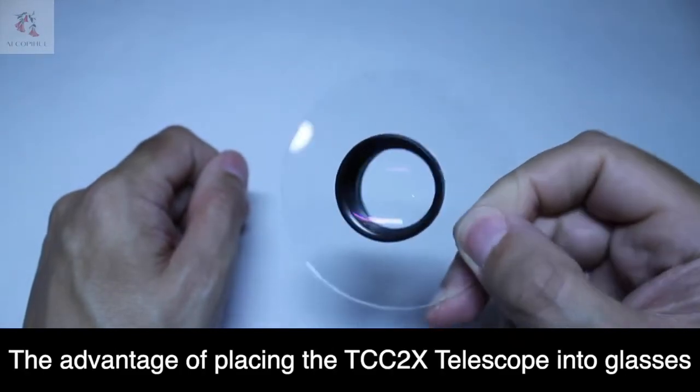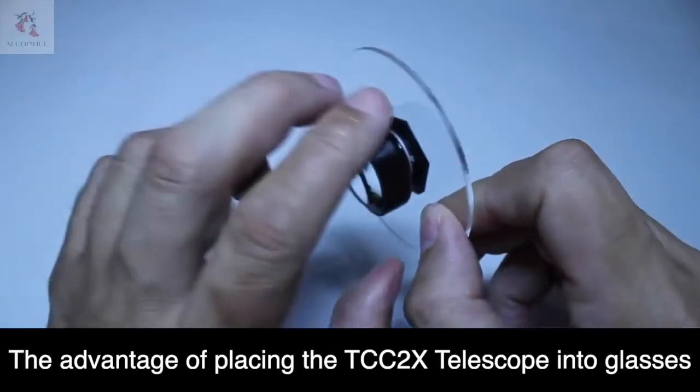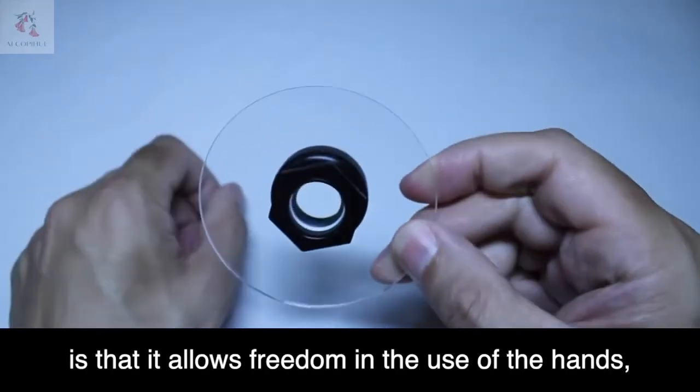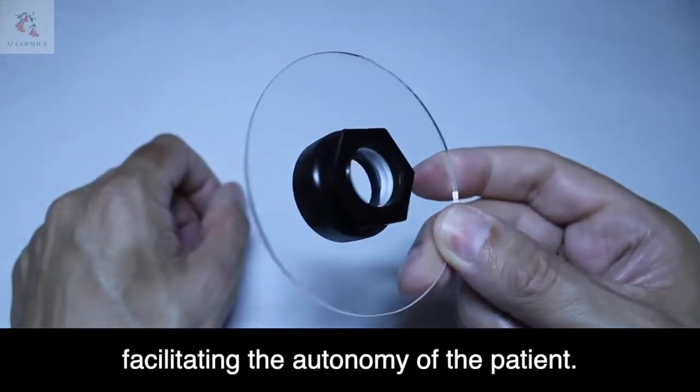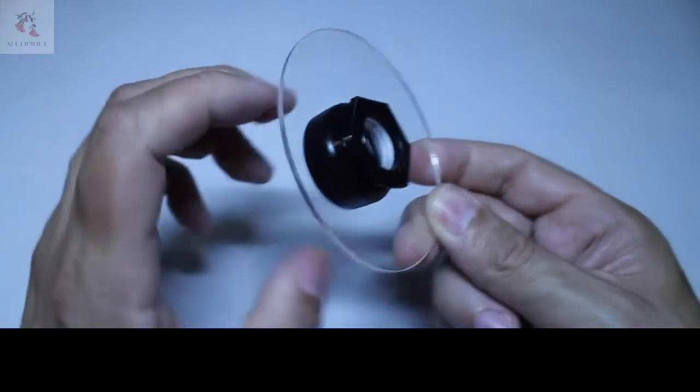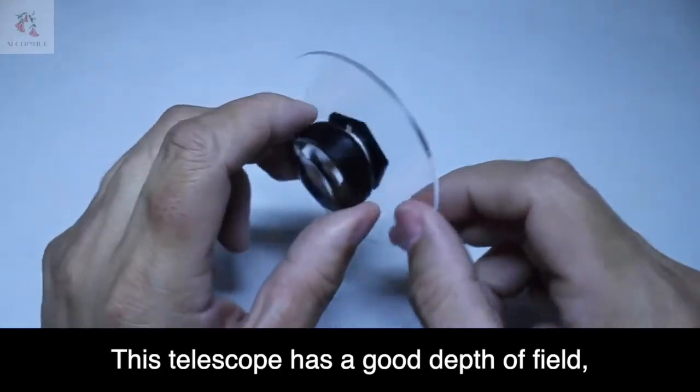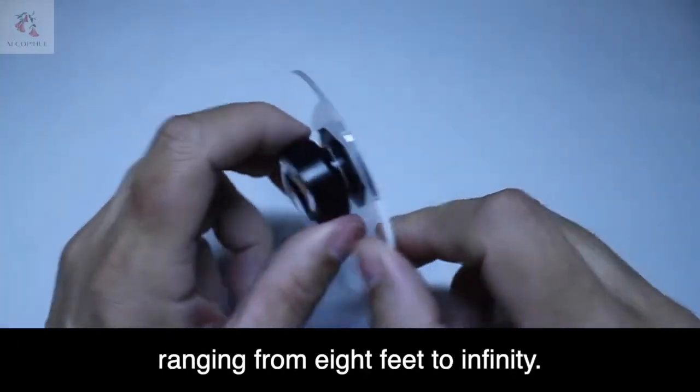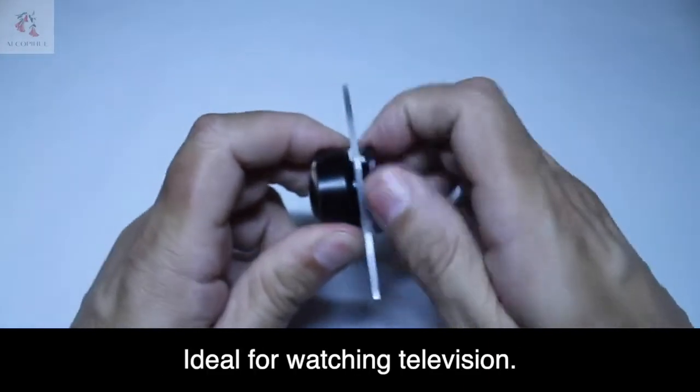The advantage of placing the TCC-2X Telescope into glasses is that it allows freedom in the use of the hands, facilitating the autonomy of the patient. This telescope has a good depth of field, ranging from 8 feet to infinity, ideal for watching television.